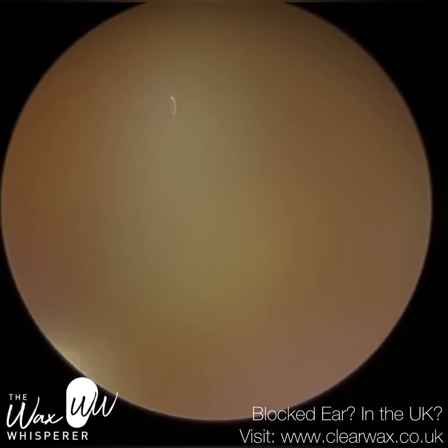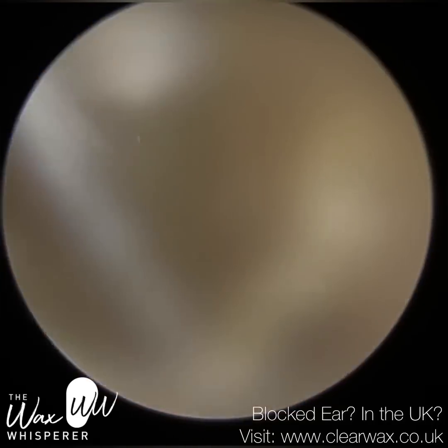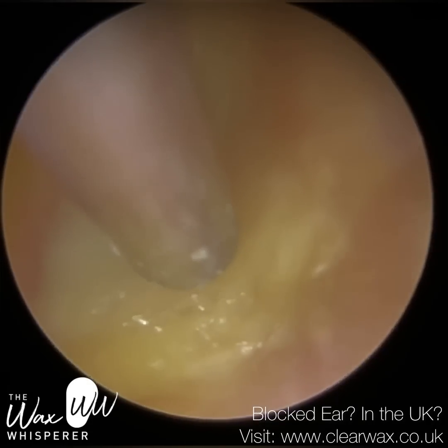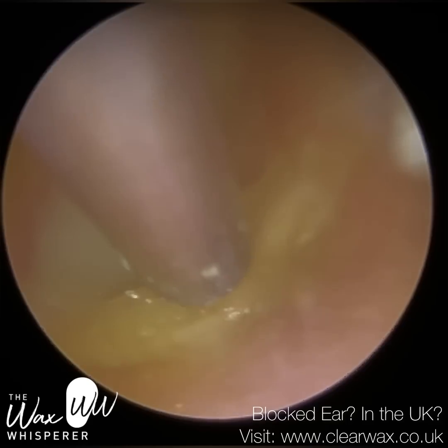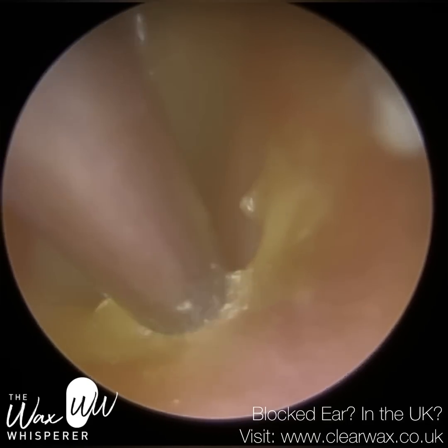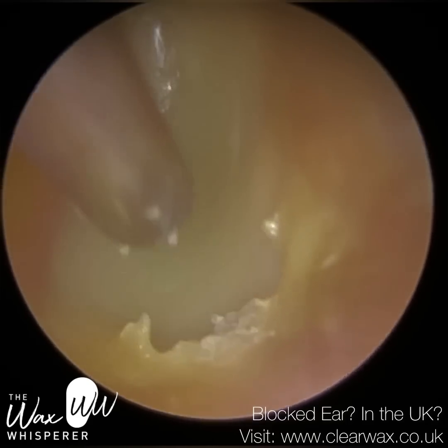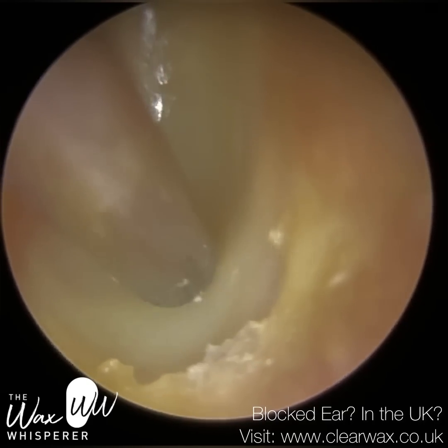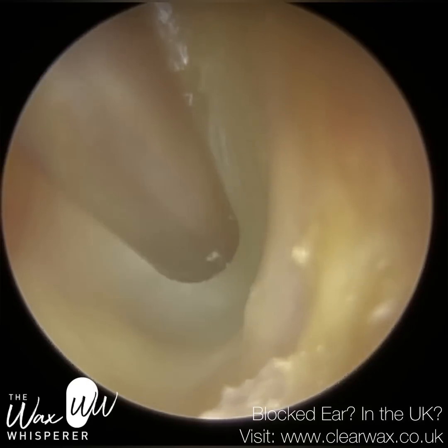We have here a patient who attended with otitis externa of their right ear. Otitis externa is an umbrella term given to an infection or inflammation involving the outer ear. And the outer ear consists of the pinna, which is the flaps of cartilage we have on either side of our head, the ear canal itself, and the outermost layer of the eardrum.